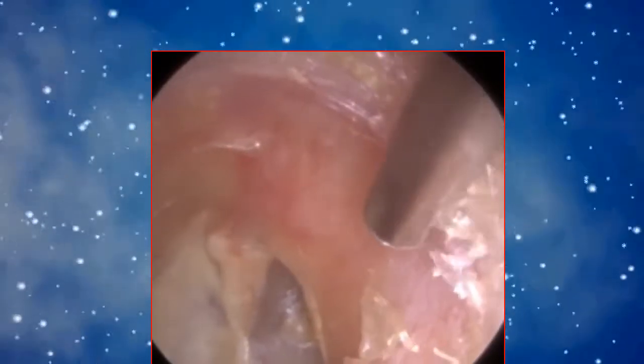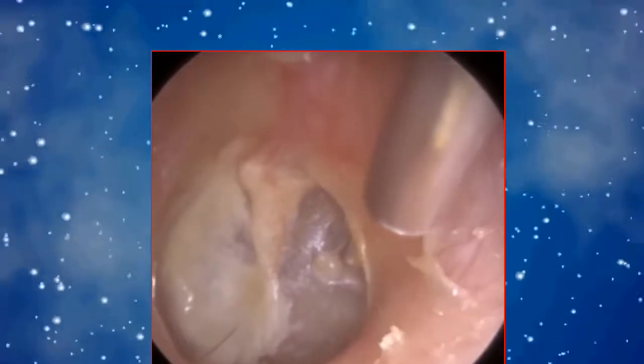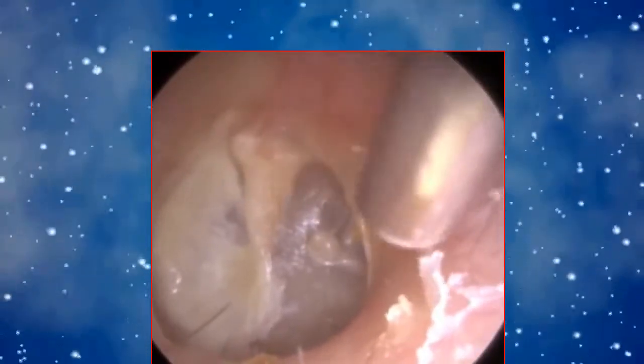So the occlusion has been removed. I'm just using a fine end suction probe just to peel off any dead keratin around the edge, and you can just see the view offered by the endoscope. It's stunning, and you can see the eardrum in the distance, and you should already be able to detect the abnormalities. The right hand side of the eardrum, that's all scarred. We call that tympanosclerosis. The left hand side of the eardrum, that's retracted, so it's sucked in.